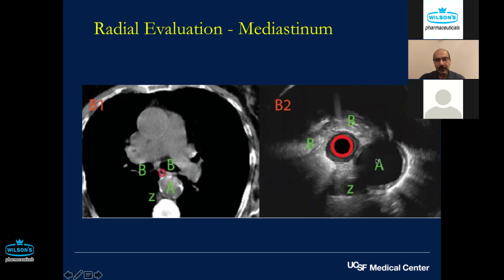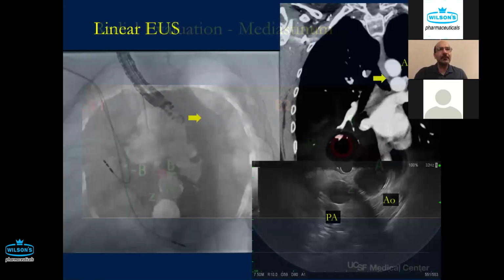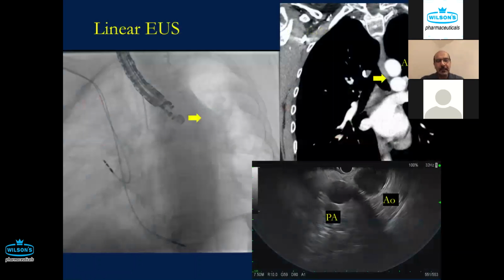And then you can see the aorta. The challenge becomes the linear. I've often thought of how best to teach this and make people understand. From my perspective, the best strategy I could figure out was to do some fluoro images while I was in a patient I was doing an EUS on. You can see that there are some leads. This was an 80-plus-year-old patient. We were doing an EUS and ERCP anyway, and I figured a few extra images wouldn't be very harmful to the patient, but educationally this would be very valuable.